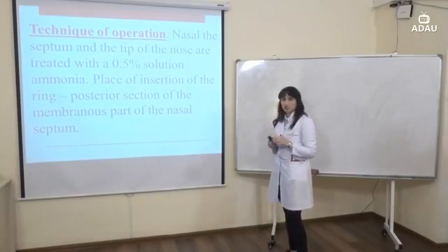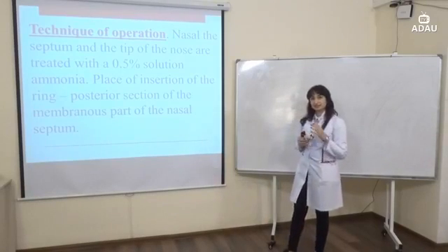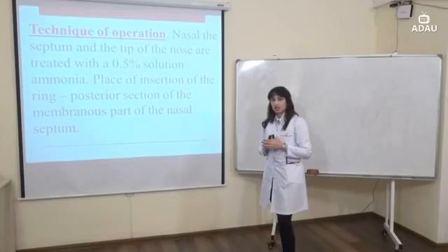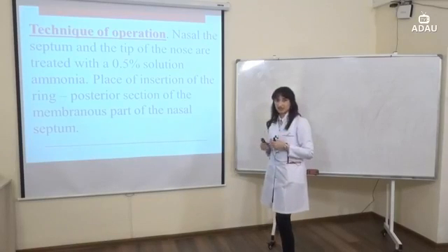We can see a section of the membranous part of the nasal septum. This is the main important place. This is where we should insert the restricting ring.